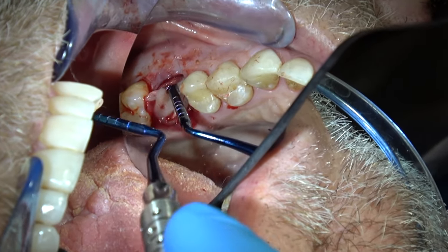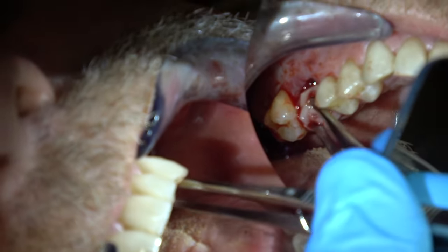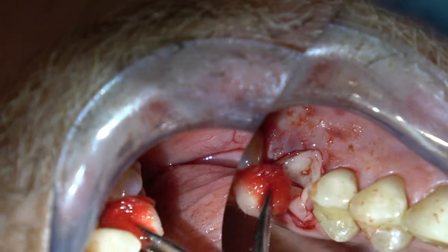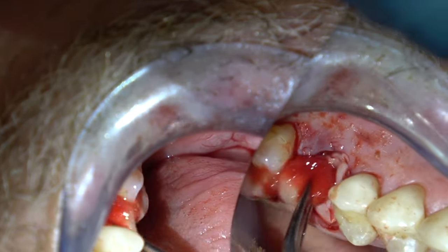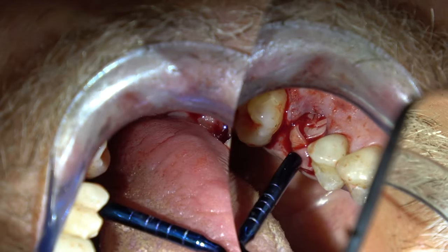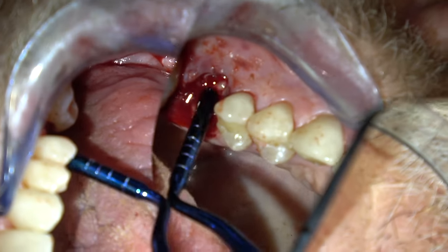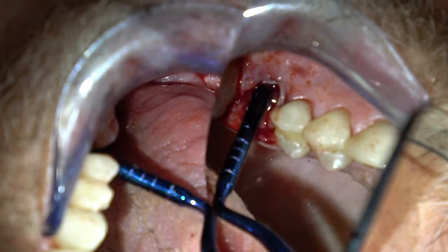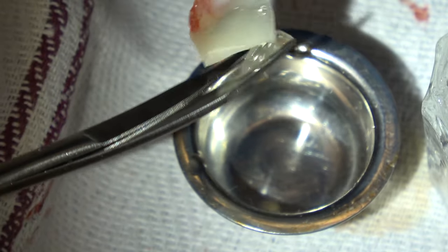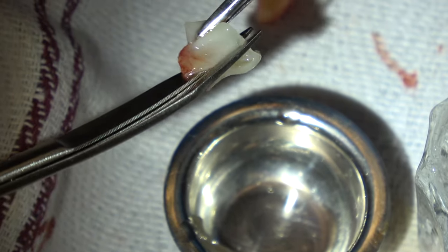Then I'm going to place those strips of platelet-rich fibrin in the socket. It's kind of like working with jello, so you're going to have to place something flat on top of it to push it into the socket. The PRF — platelet-rich fibrin — is rich in growth factors, so it forms a very nice alveolar process. I'm cutting this platelet-rich fibrin and placing a flat strip over the top of what I've already pressed into the socket, so I've got something flat to push against.